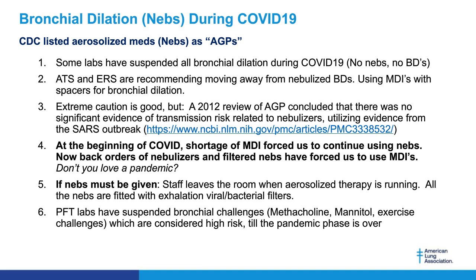Since we do a lot of pentamidine inhaled antibiotics, we have to do nebs because many of these patients' lives depend on getting their antibiotics, especially the patients on pentamidine, who usually have failed all the other oral meds. The American Thoracic Society and the European Respiratory Society are recommending moving away from nebulized BDs, using MDIs with spacers for bronchodilation instead. I have another slide with our protocol that will be coming up soon.